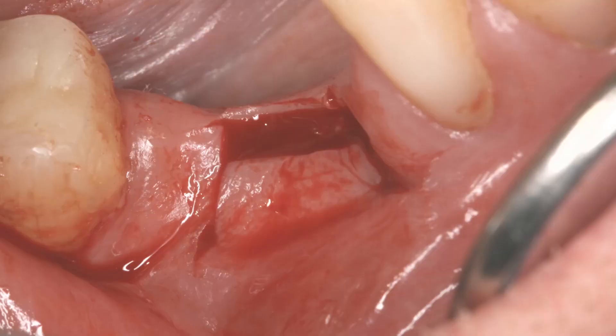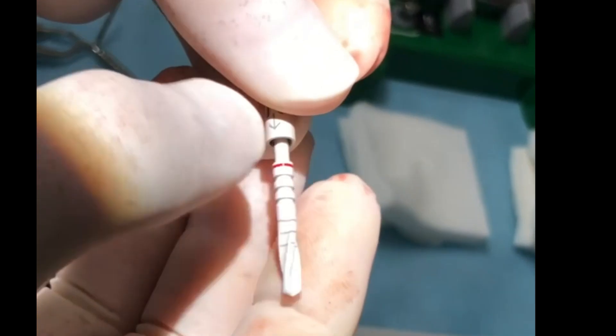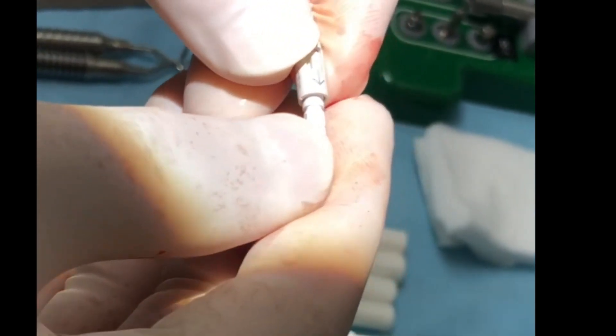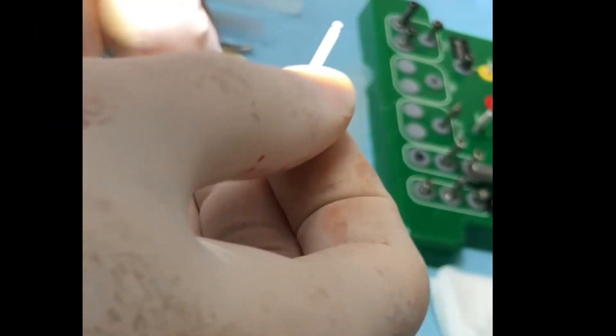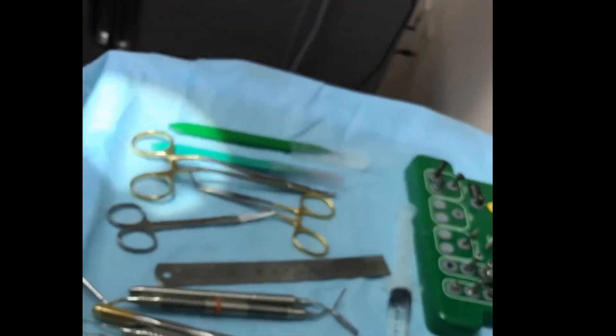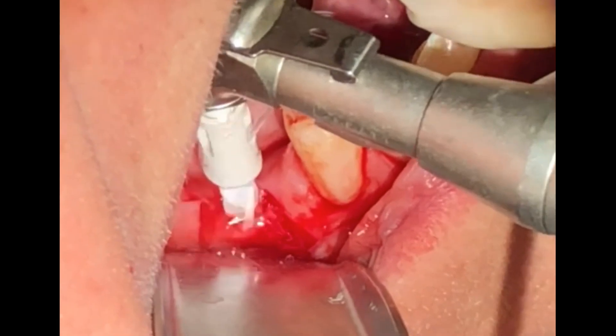Osteotomy is initiated with drill stops for each consecutive size. The Z Systems kit is equipped with one drill stop per drill, and the desired length can be set by engaging that stop on different notches along the length of the drill.